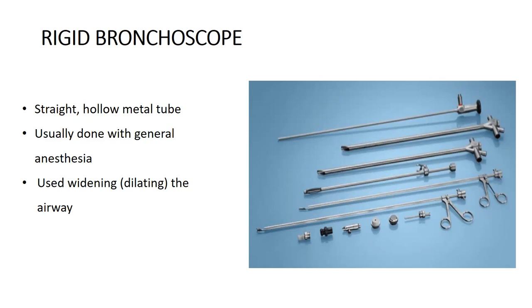So in a patient with a tumor, it is the same as upper GI endoscopy or colonoscopy. But in a patient with life-threatening hemoptysis, bronchoscopy is more diagnostic than therapeutic. That is the major limitation between upper GI endoscopy and bronchoscopy.